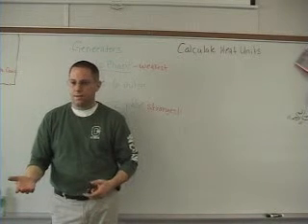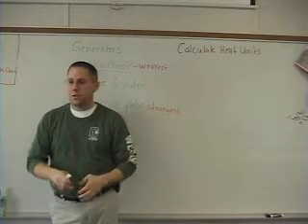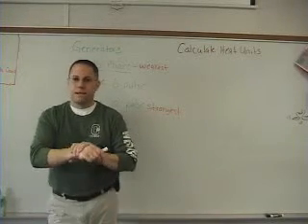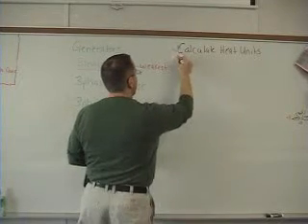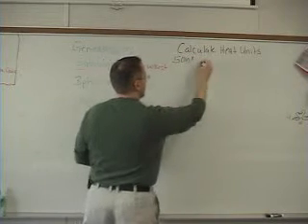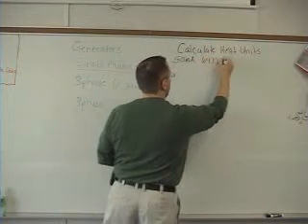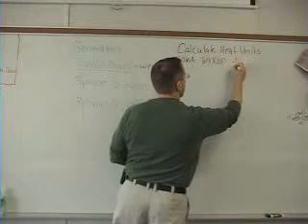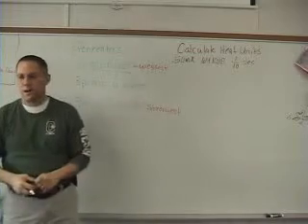So let's say, for example, we're going to do an X-ray of the wrist, and it tells you to use 50 milliamps, 64 kVp, and 1/10 of a second. Those are our 3 exposure factors.